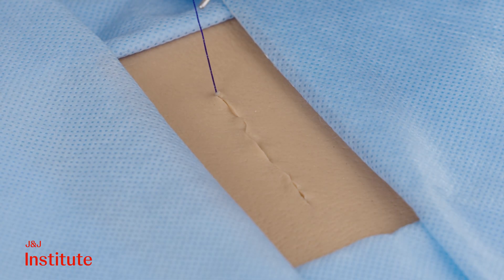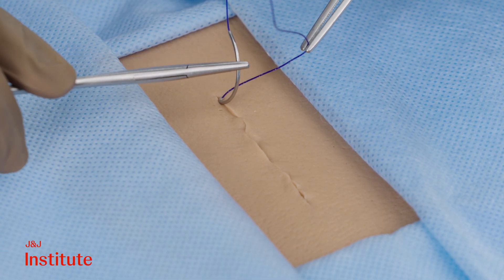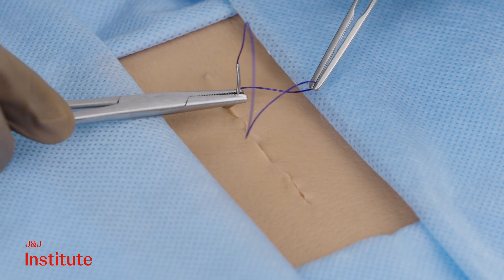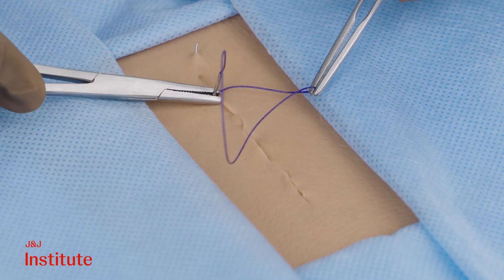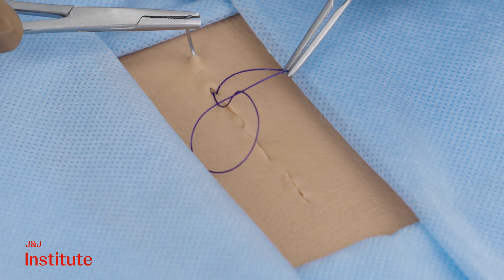Upon reaching the incision's end, the needle is passed through the end of the incision in the dermal plane, staying as superficial as possible, emerging a short distance away from the incision.